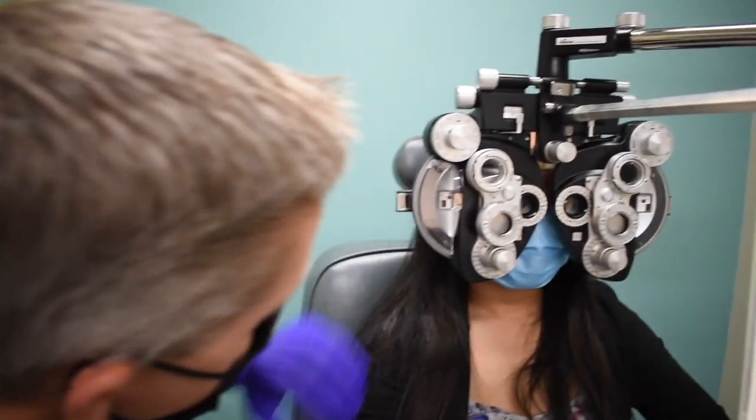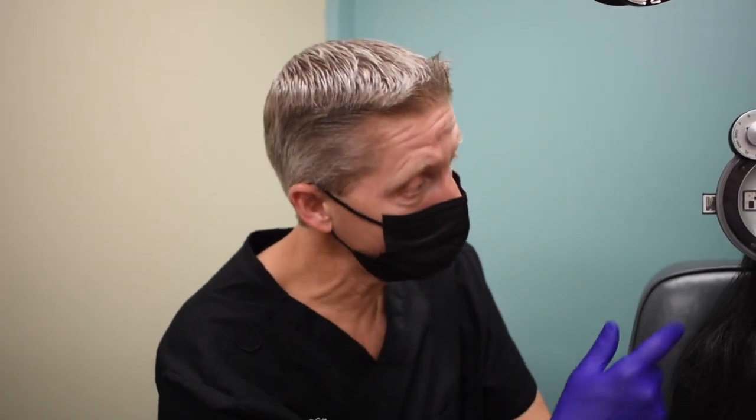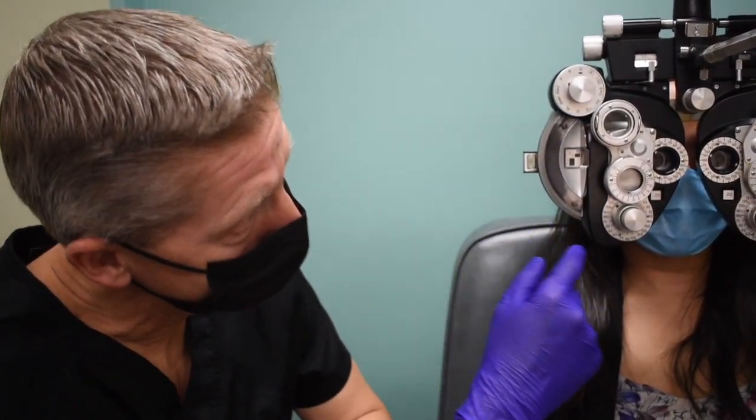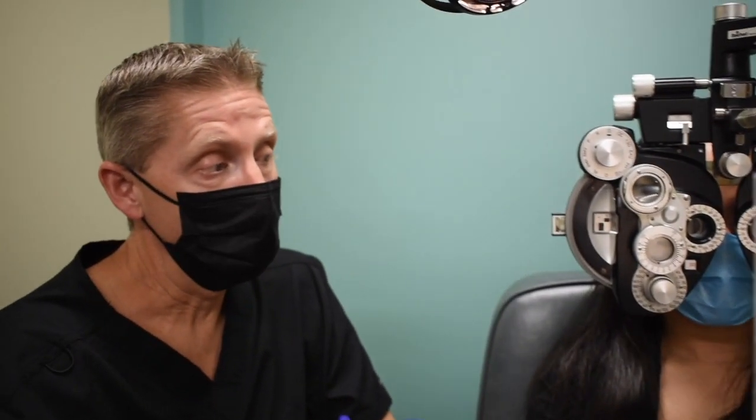So here we have an add power for Mrs. Jones of plus 75. And the add power is a net. We started out with plus 75 in the phoropter, and Mrs. Jones subjectively liked an additional plus 75. So that tells you that the add power for Mrs. Jones is plus 3/4 of a diopter. Her distance prescription would have been plus 75 in the right eye and plus a quarter in the left eye, and then it would have a plus 75 add power. Okay, that's one method for determining the add power.